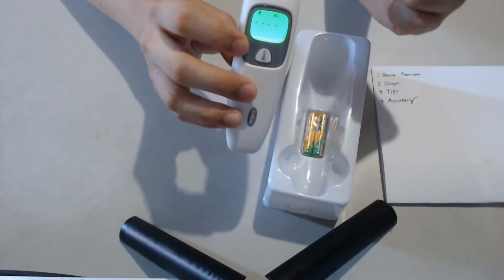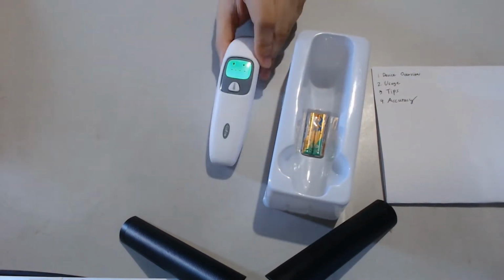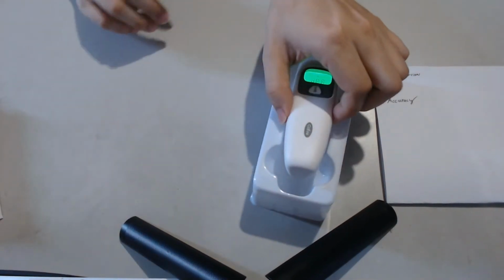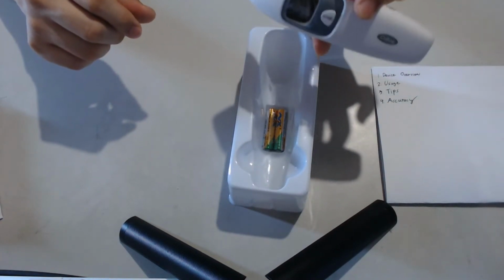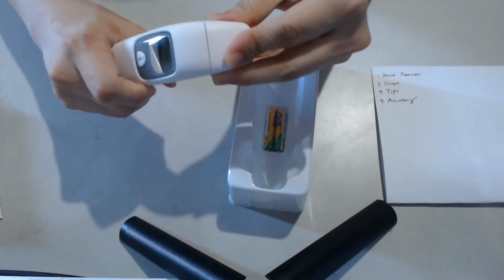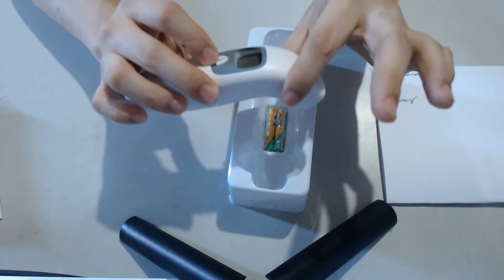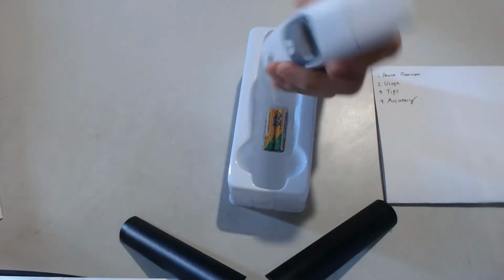Now we go to measurement mode. This thing has an undocumented feature. It is not displayed in the manual, nor on the product page, but it actually has a third measurement mode. A while ago, I told you guys about the forehead measurement mode and the ear measurement mode, depending on whether this piece is on or off the device. This one can also measure a general object similar to this. Why is it different? I'll get to that later.